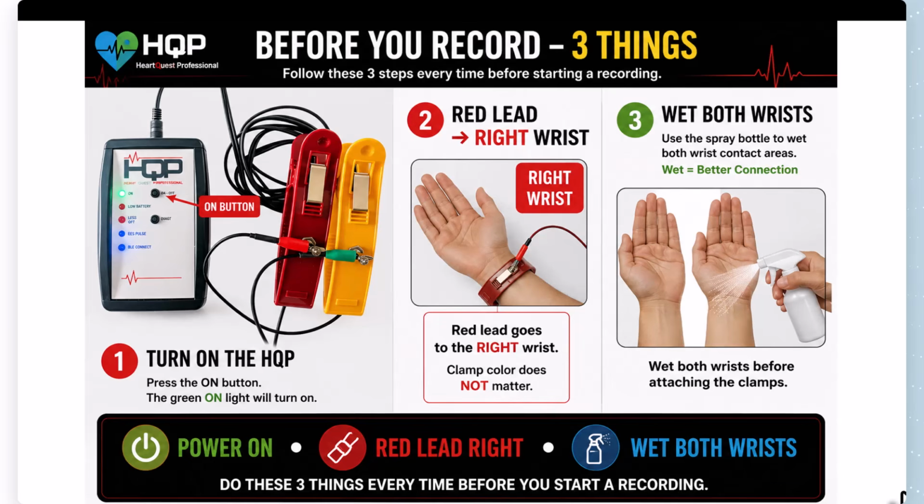Now you'll notice on this version, the red lead, which is the plastic piece on the cable itself, goes on the right wrist, and the green one goes on the left wrist. It doesn't matter what color clamp you have at all. It's all determined by those plastic leads. The other thing is you want to make sure that the metal plate inside of the clamp goes on the inside of the wrist. Before you do that, you want to spray both wrists with water, just plain water, and then put the clamps on.